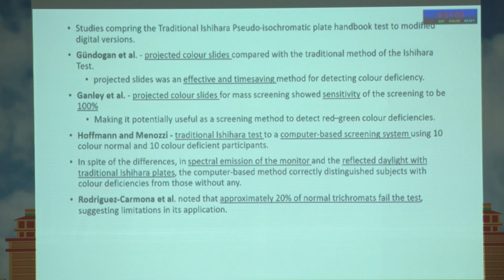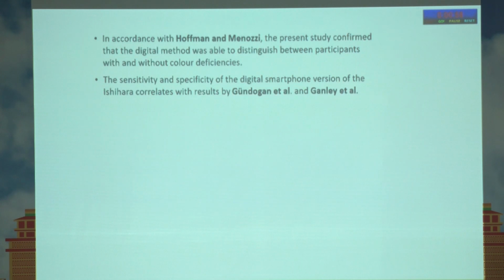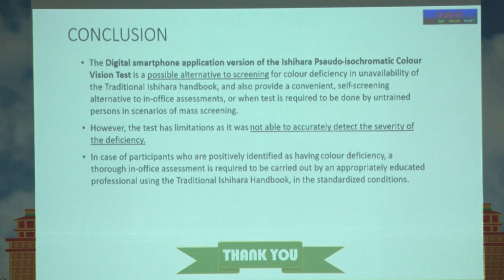Rodriguez found 20% of the normal trichromats failed the test, suggesting limitations in its application. In accordance with Hoffman and Menozzi, the present study confirmed that the digital method was able to distinguish between participants with and without color deficiencies.